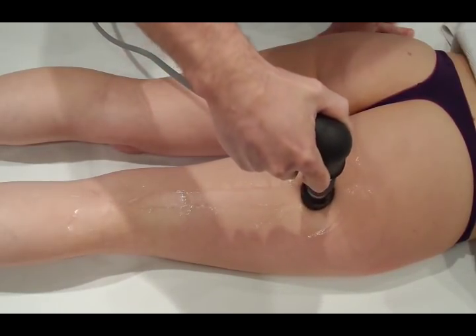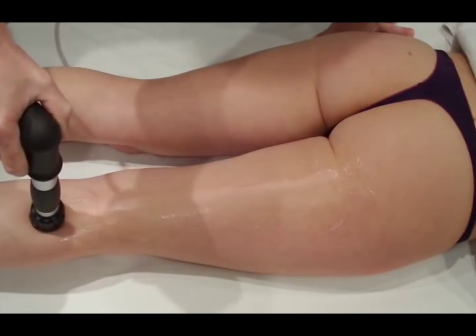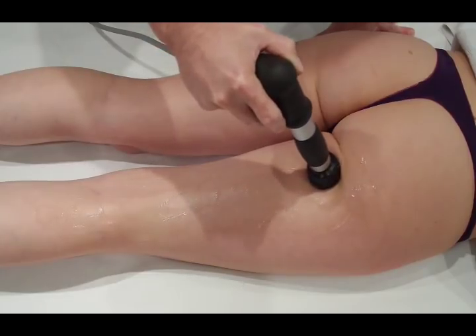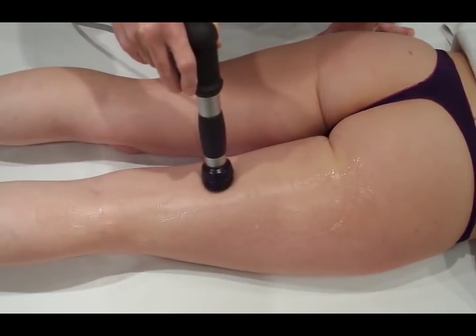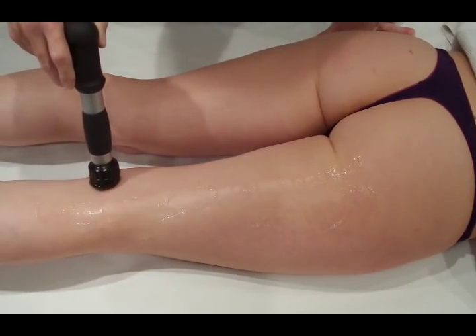The idea is to equally spread out the 3000 shocks across the whole of the muscles. You're never probably going to be able to do that perfectly — just do as much as you can on the worst areas and a little bit less on the better areas. Just keep working your way up and down.